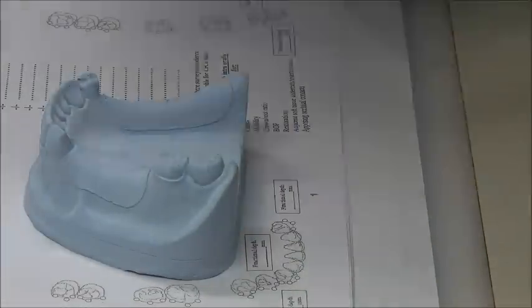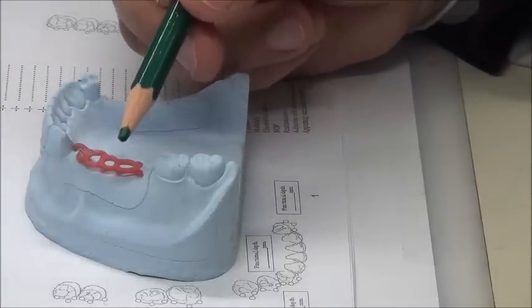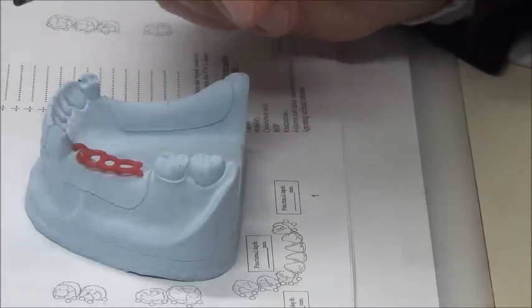So the very basic, easiest design for any bounded saddle is Akers and an open lattice. What are the things that make us move from the open lattice to a mesh? The major indication is occlusal clearance. An open lattice is thick. If I place an open lattice here, I could do that, but the problem is it has some inherent thickness. Can I place a tooth over it and get good occlusion? This is my question.